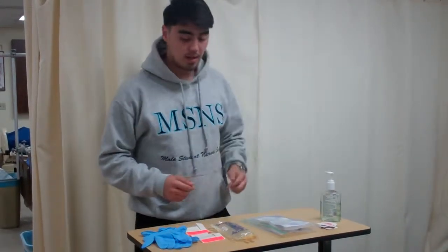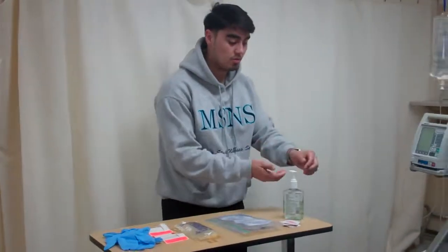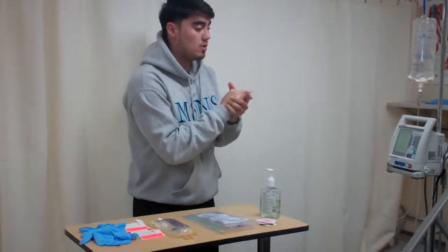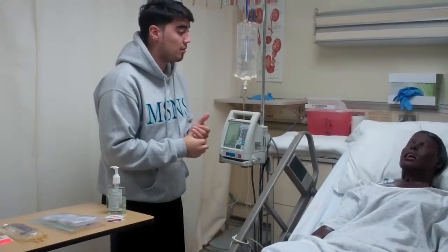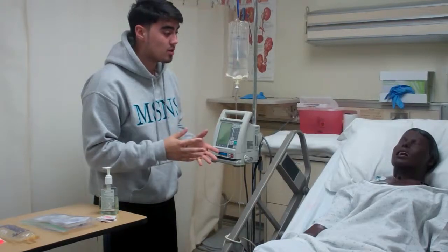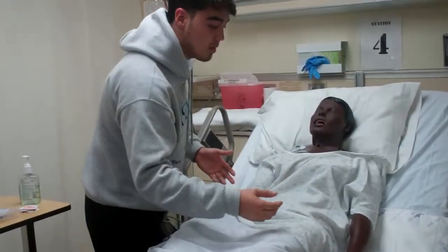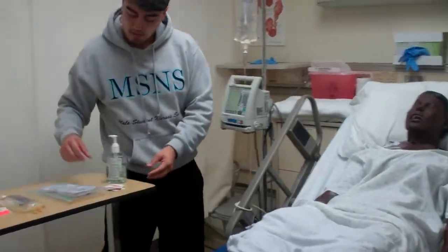So now that we've done that, the next thing we're going to do is introduce yourself to the patient. So I'll walk into the room. I'm going to introduce myself. Hi, my name is Kelly, and I'm a nurse. And today I'm going to be administering your medication via piggyback according to the physician's orders. So before I get started, let me go ahead and just check your patient IDs. And then we're going to check this against the MAR. So we want to make sure that we have the correct patient. So Matt Medina. Then we'll check against the MAR.